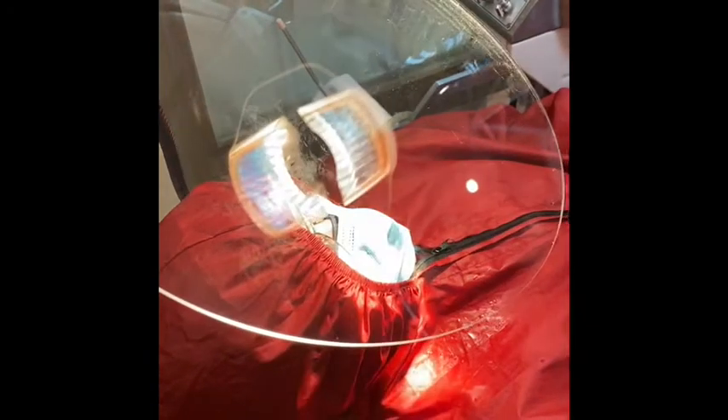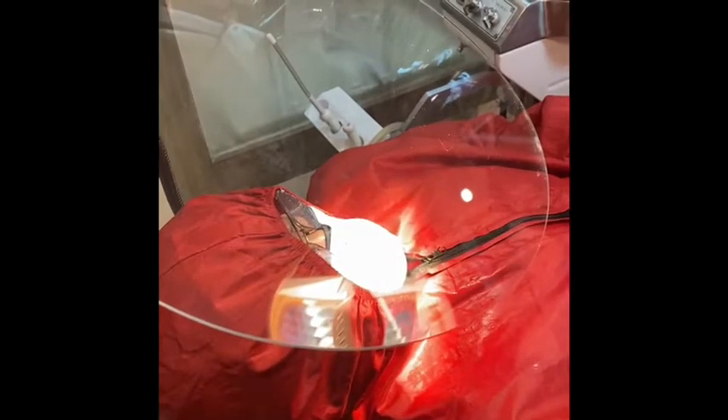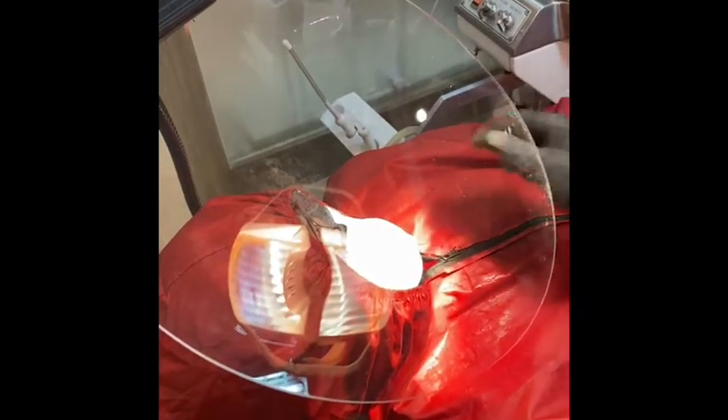Kapag po yung pasyente, ganyan, may freedom ka na ng hands mo. Yung light, adjust mo lang kung gusto mong rekta o kaya dito. Pero I find this sometimes may glare ng konti. So ginagawa ko, angle mo lang — hanapin mo lang yung angle na hindi ka magkakaroon ng glare. But it works, ha? So you can adjust it. It's light. Pati may freedom naman ka.